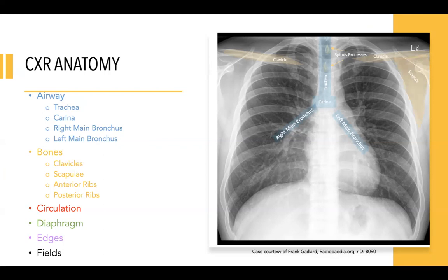When assessing ribs, the anterior ribs angle inferiorly from the lateral aspect of the image, while the posterior ribs arch superiorly from the lateral aspect of the image. With maximal inspiration on a PA view, the examiner notes 9 to 10 posterior ribs.